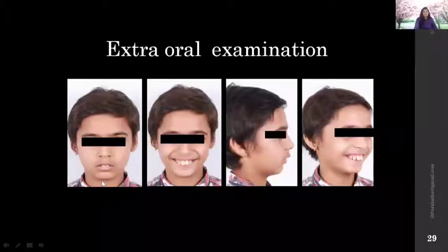Mesoprosopic face. I can make out that the mentolabial sulcus looks to be deeper here. I can also see that there is a hyperactive mentalis muscle. I can see that the incisal exposure at rest is pretty high. I also see incompetency of lips here. And I do see the perioral musculature is very much active. Hyperactive mentalis as well as the perioral musculature is hyperactive.